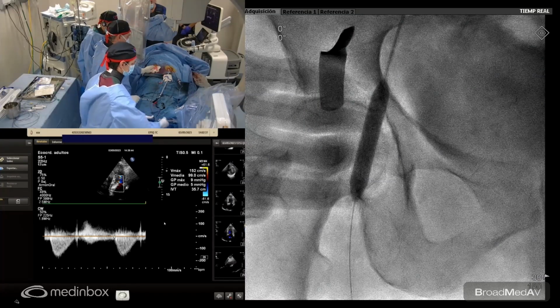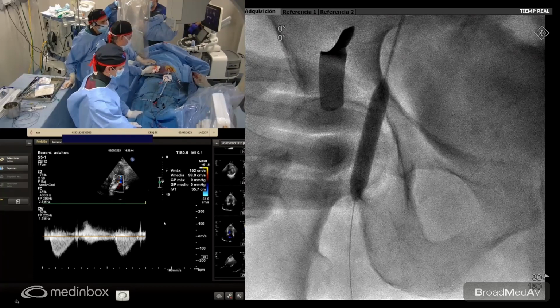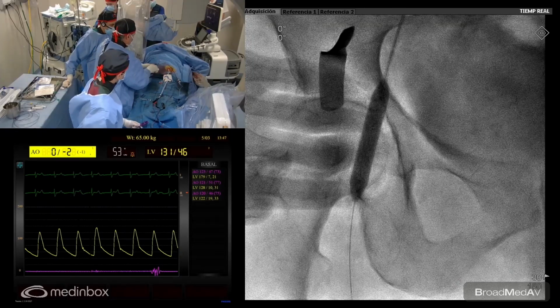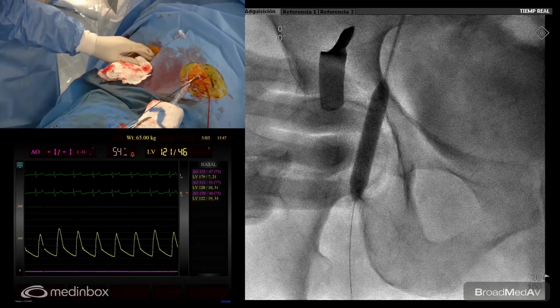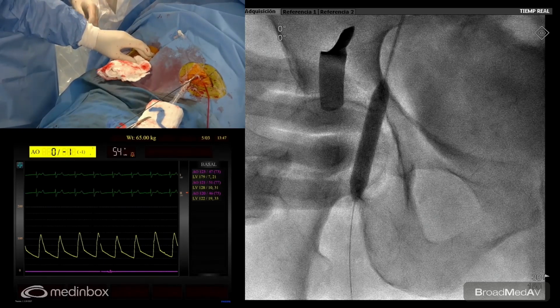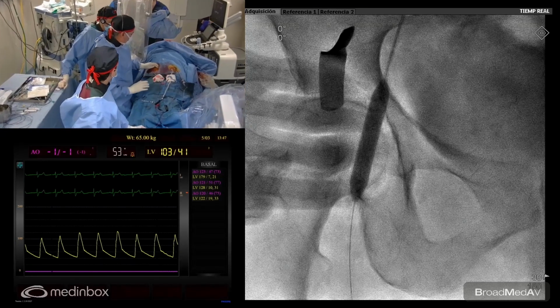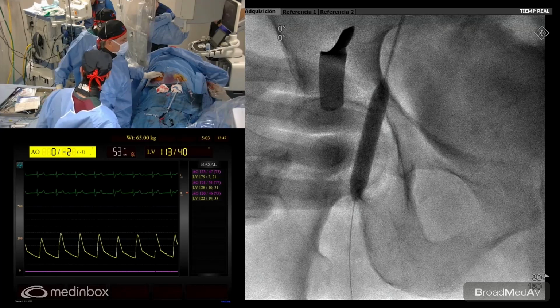Deflate, Juan. So the balloon is deflated, but we still have to hold the groin for additional minutes. Because if the sealing was not perfect and you release now, probably you are wasting the time of the balloon inflation. So it's better to be sure that you have held the groin long enough to get good closing. I'm just holding very softly. We don't have bleeding, but anyway, I would like to keep it there for at least 2 or 3 additional minutes.